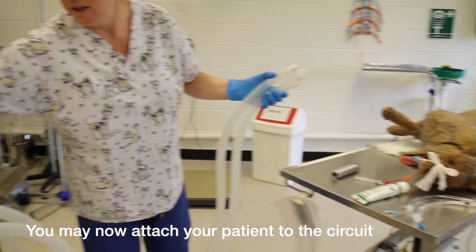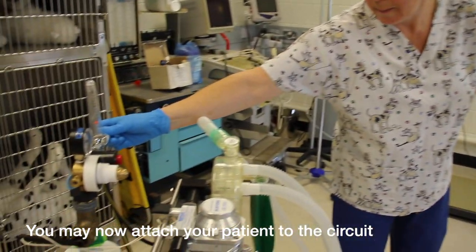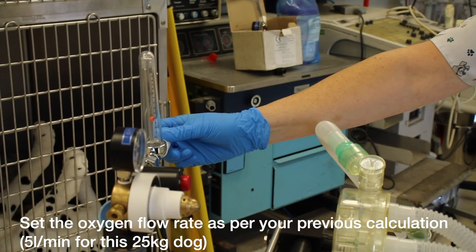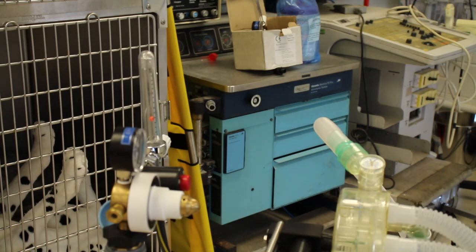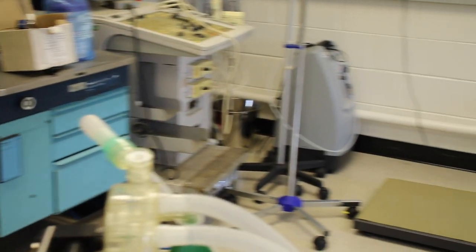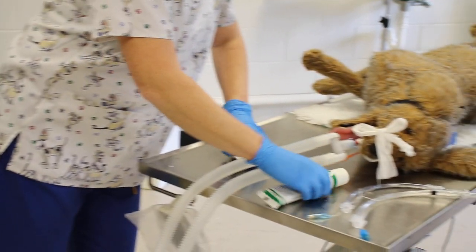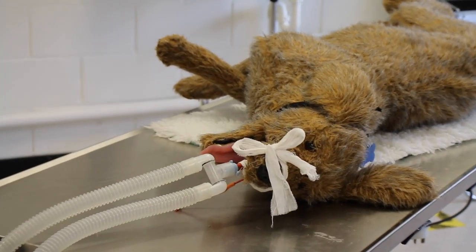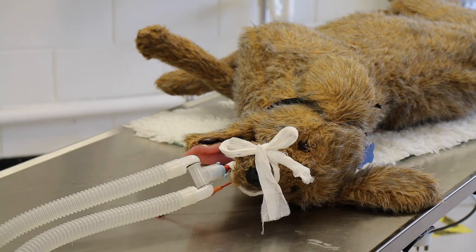We set our oxygen to five liters so the bubble sits exactly in the center of the flowmeter, and we connect our patient.